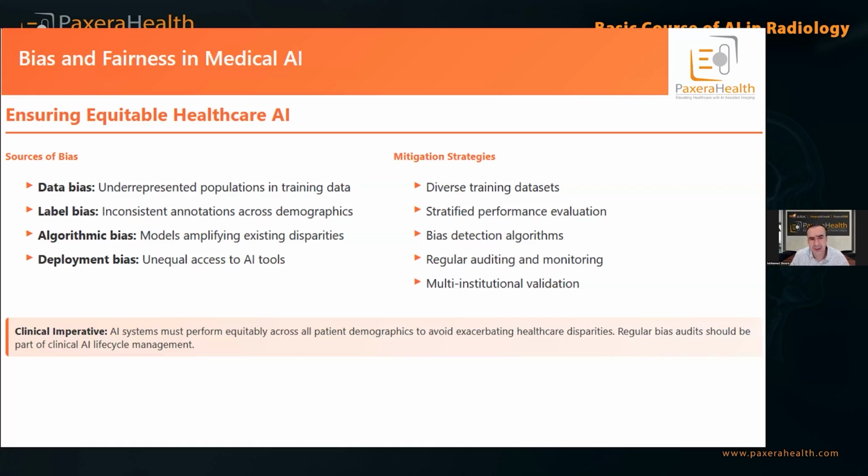One of the problems with the publicly available data sets existing over the internet, which some large organizations have shared, is that some of them are not really labeled in the right way, and some of them are not labeled by radiologists. So if somebody uses them without extra validation, it will cause bad performance of the models.